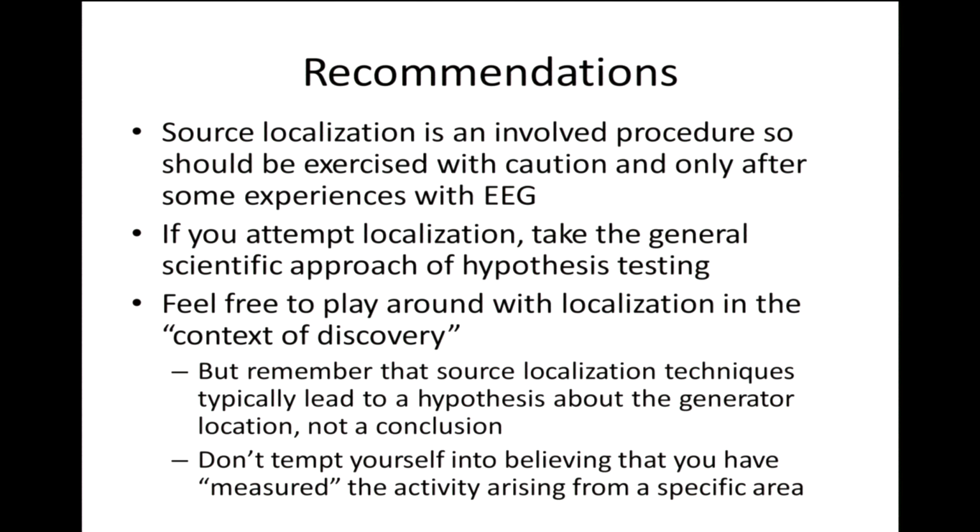If you want to do source, it's better first to get clear EEG or ERP signal differences in those established measures, and then you want to see where in the brain those measures differ. So source reconstruction should not be your first line of approach. That's the point.